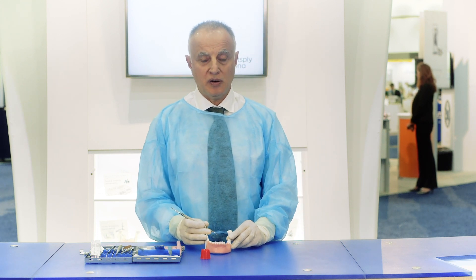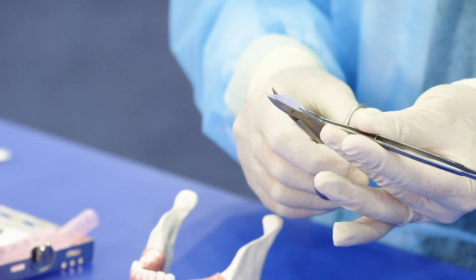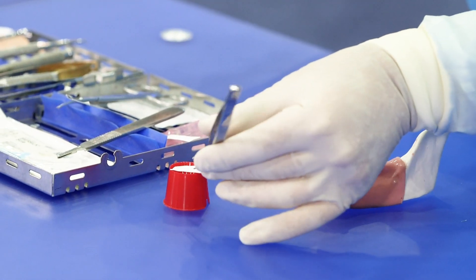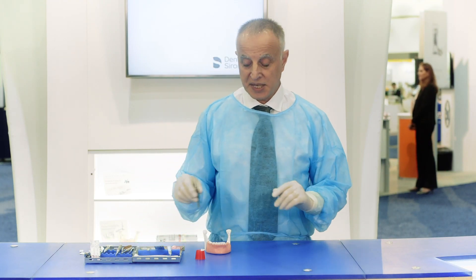The site is now ready for the placement of the O6 Plus membrane. The first thing that we do is cut the membrane and hydrate it in sterile saline. The hydration should be for 30 seconds.